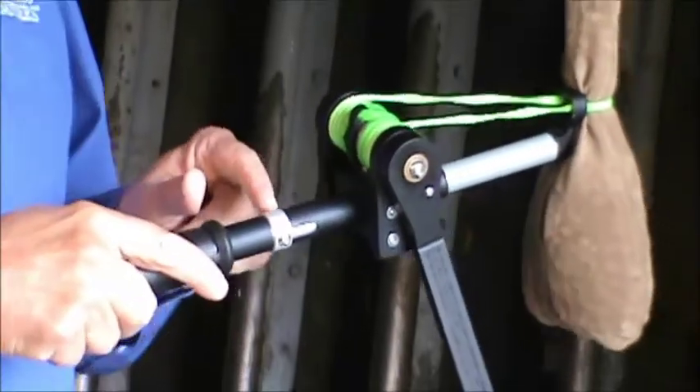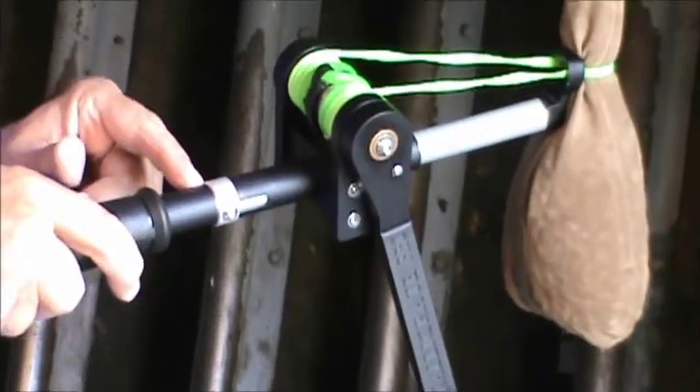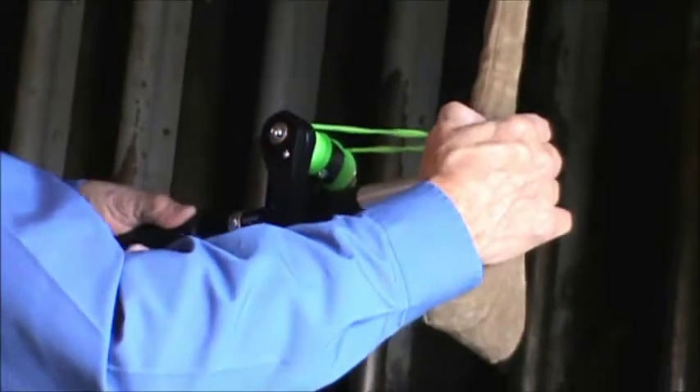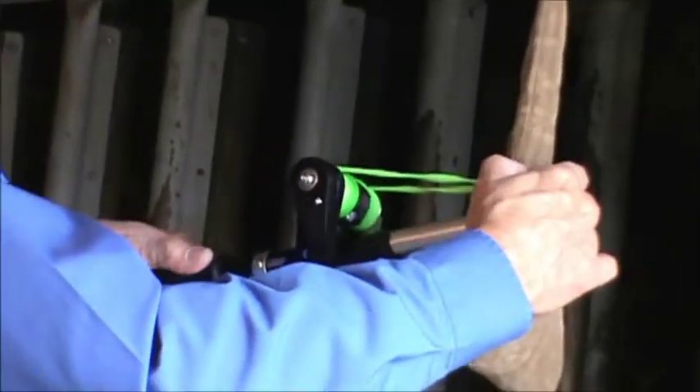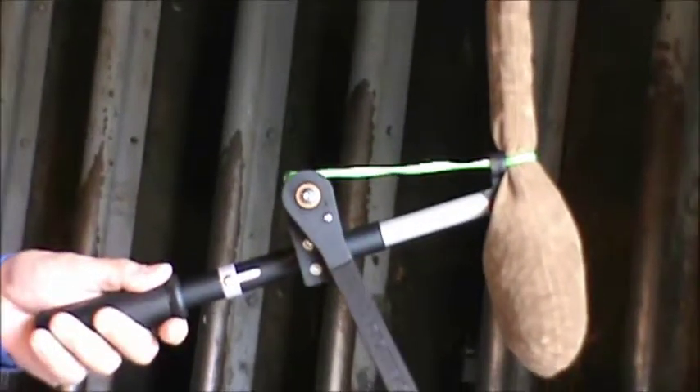I've brought the tension indicator all the way back to the scribe line and no further. This is a properly tensioned loop — it's good and tight. Now we're ready to release the loop from the tool.